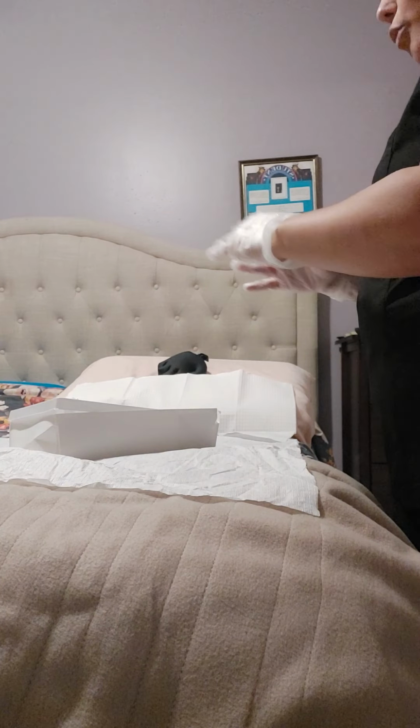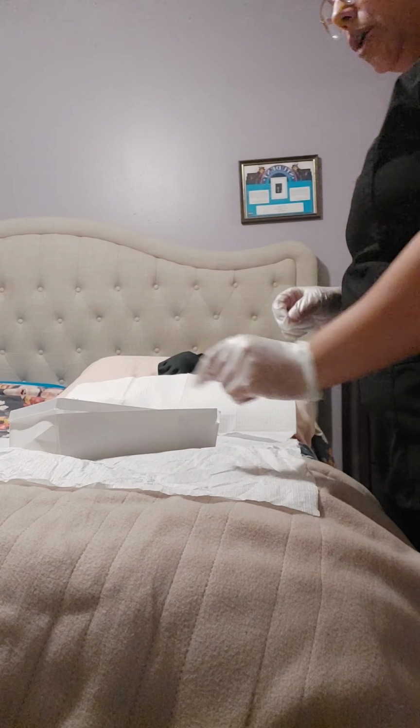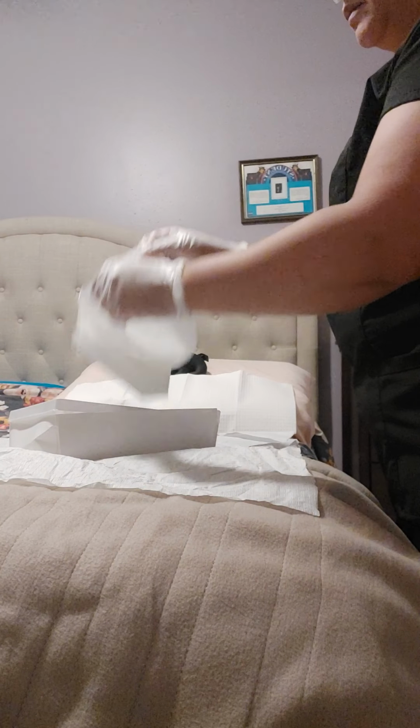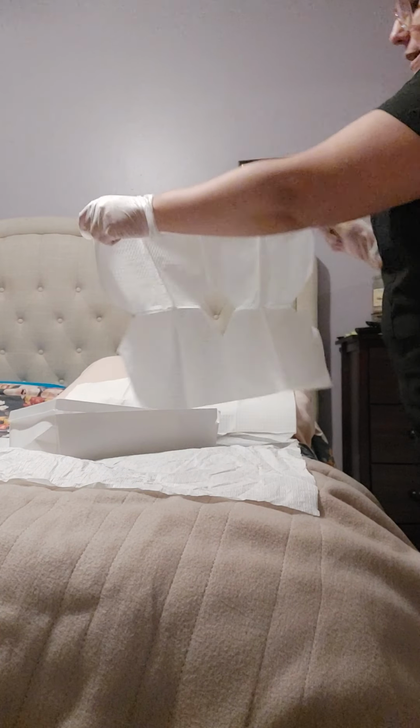Then I would inform my patient that I also have a drape that I would put over the area that I will be working on so that it only exposes the area we will be working on. And also with the glossy side down.